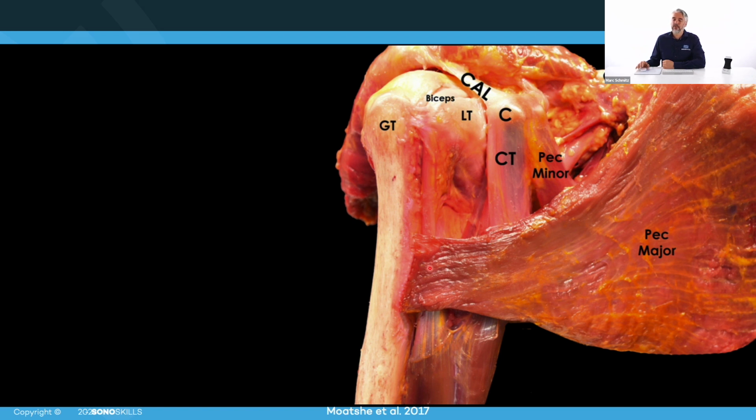At this level, this is the first point where we are going to do a functional check. So we're going to ask the patient to make an external and internal rotation. And with that, you give a stretch to the biceps. And this is a spot where you can see tearing of the pectoralis major tendon or the latissimus dorsi, and in many cases also affecting the long head of the biceps. It's a real interplay. They work together and they should be regarded as a functional unit.